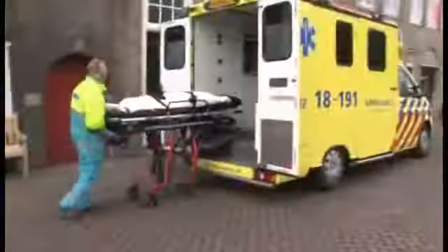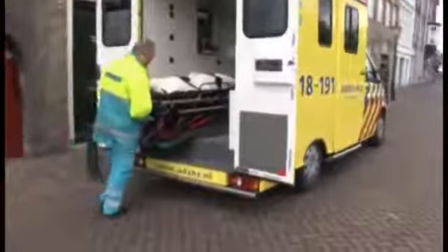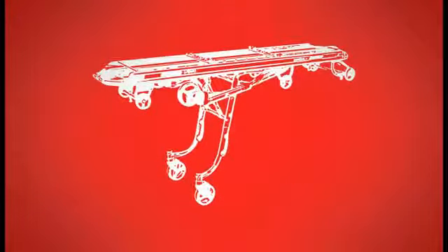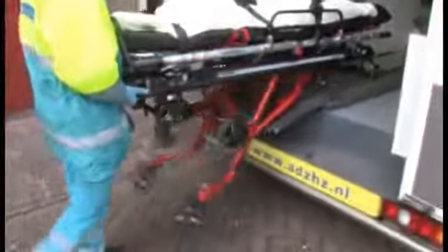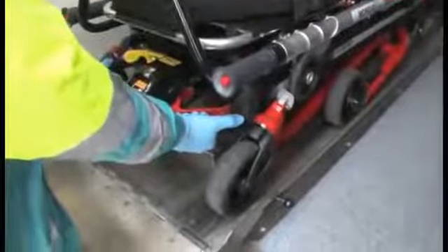Loading and unloading the cot. Loading and unloading the Mondial is easy with the Easy Load Auto Release system. To load the cot, grasp the cot at the rear and push the cot onto the loading tray in a smooth, continuous motion. As the front load wheels contact the tray, the front legs will release automatically. As the center load wheels contact the tray, the rear legs will release automatically. Continue pushing until the rear load wheels are on the tray and the cot is locked into the fastener.